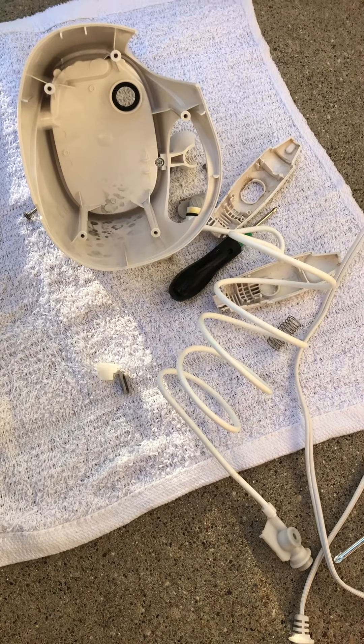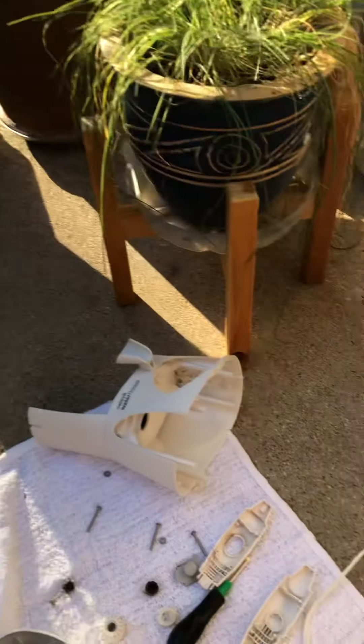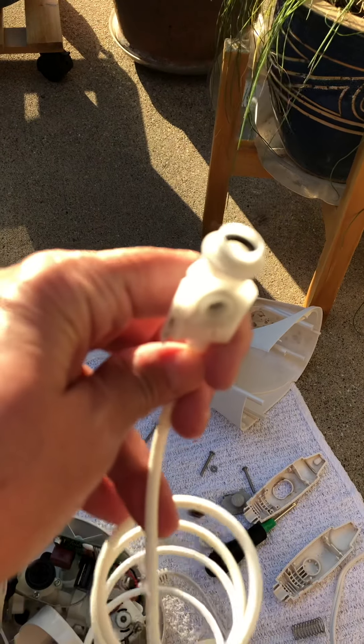I'm going to save that hose. What's interesting about this hose is I'm going to clean it up on the end — that yellow stuff. And I'm going to clean this thing up. It looks like you could literally use this without the handle.